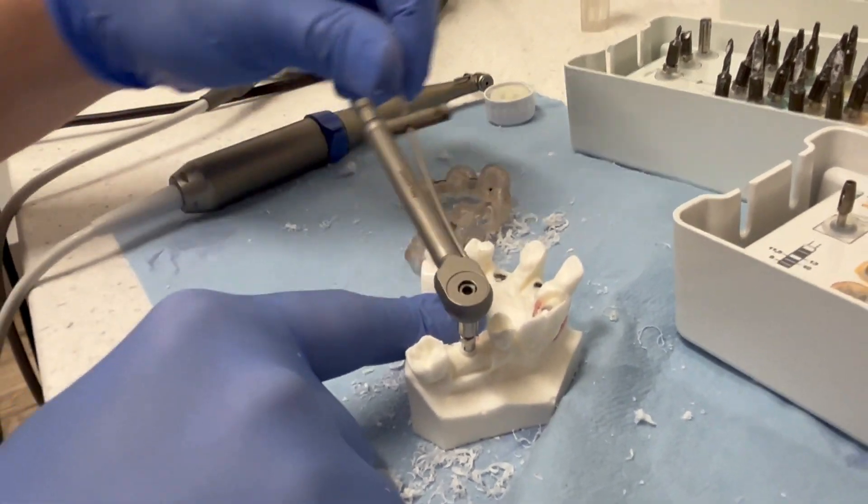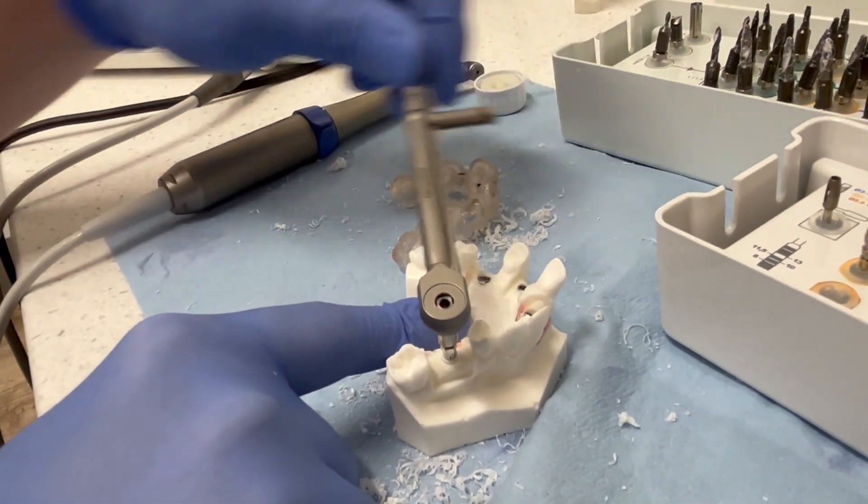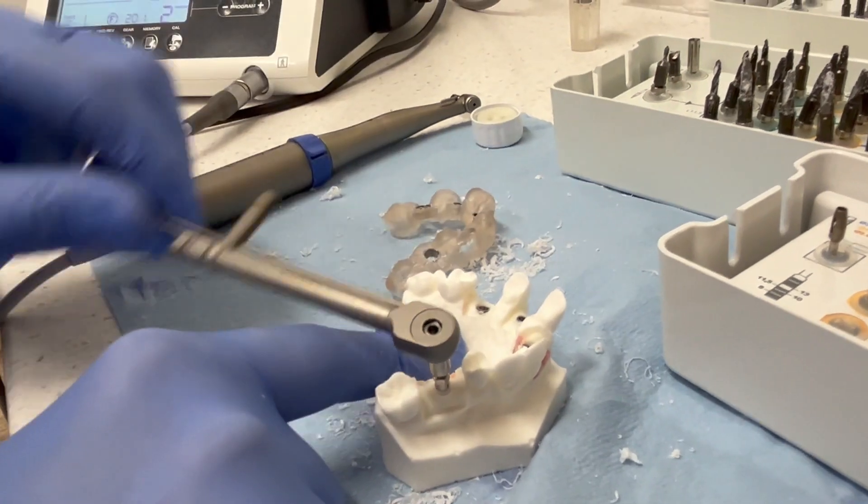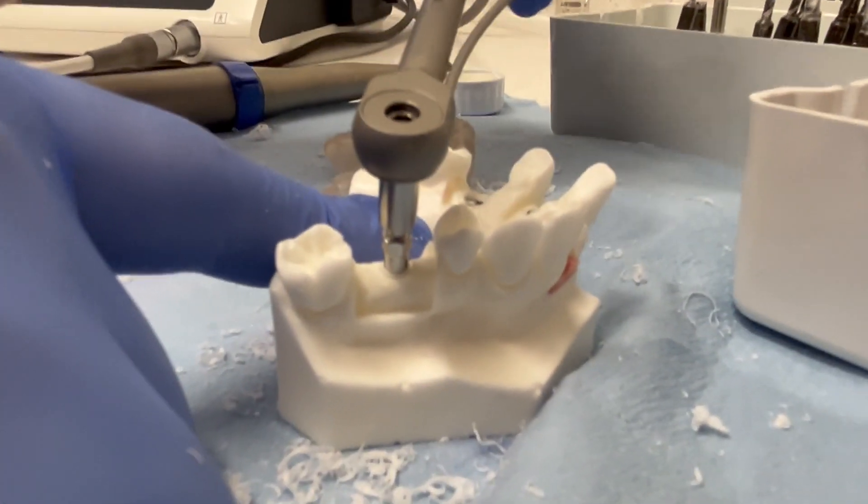Slide this on top. Same thing, always pulling from the bubble. Even more critical when we get to these zirconia implants that we don't want to over-torque them.